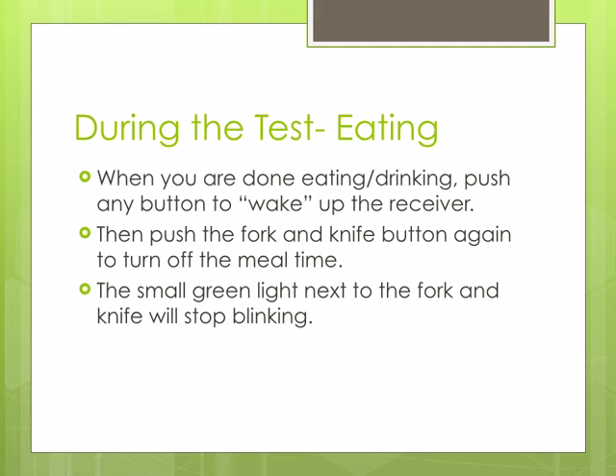When you are done eating or drinking, again hit any button to wake up the receiver. You will then push the button with the fork and knife on it. The small green light next to the fork and knife will stop blinking.